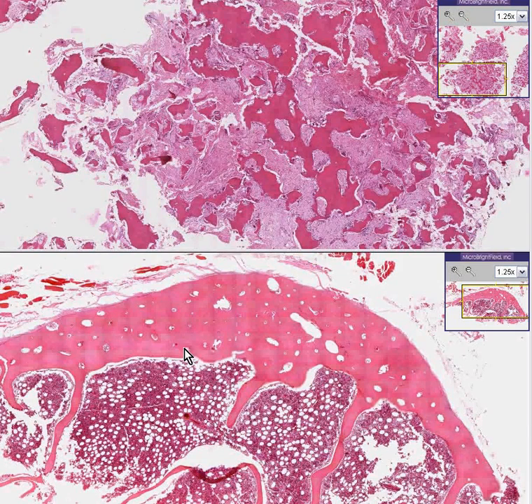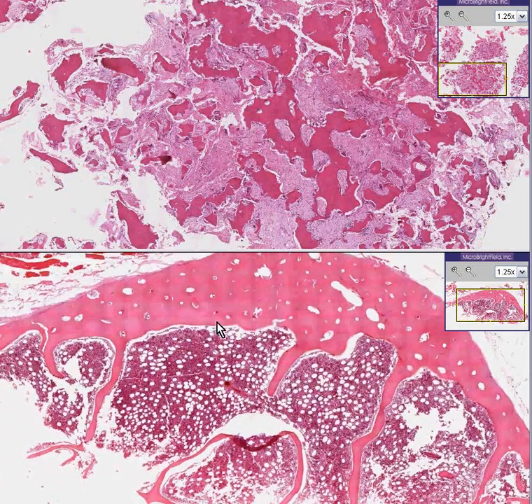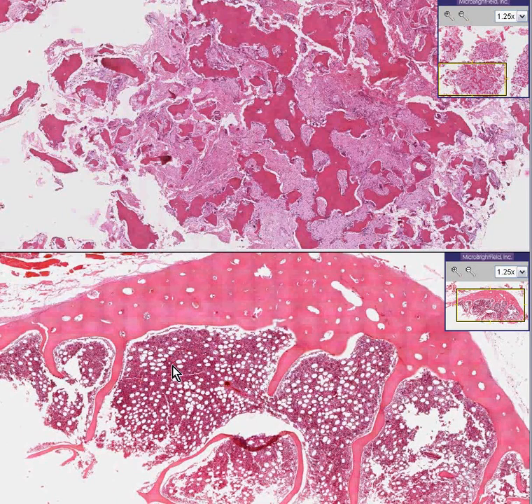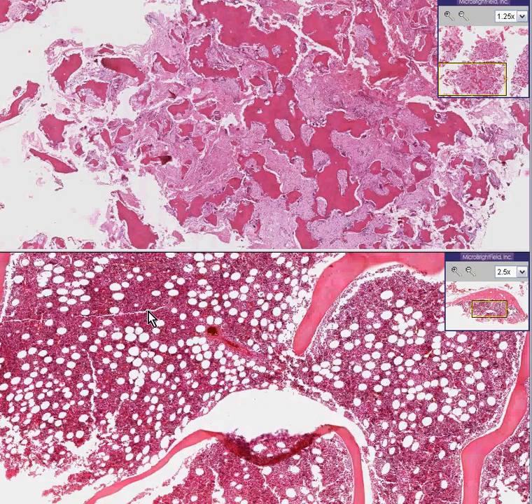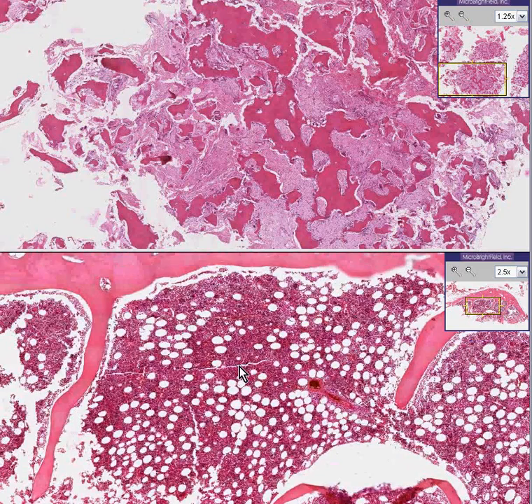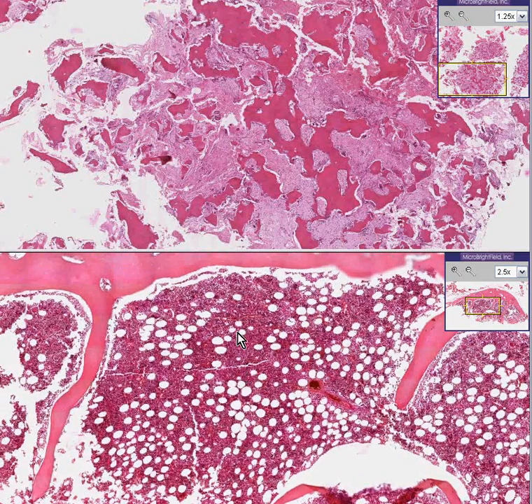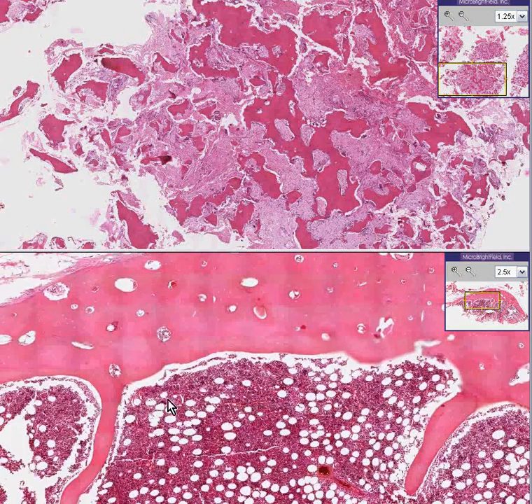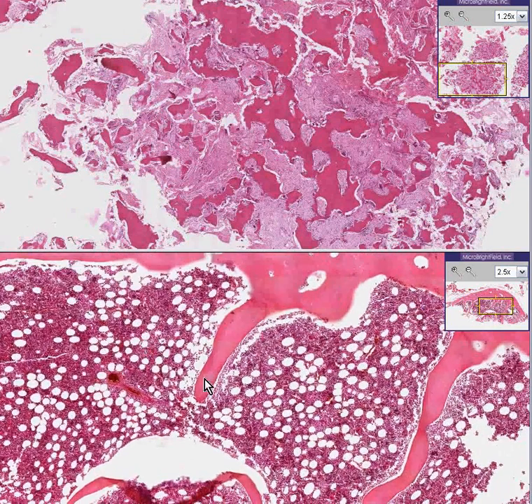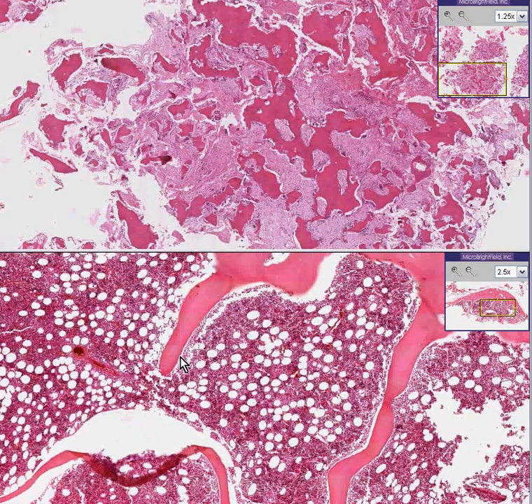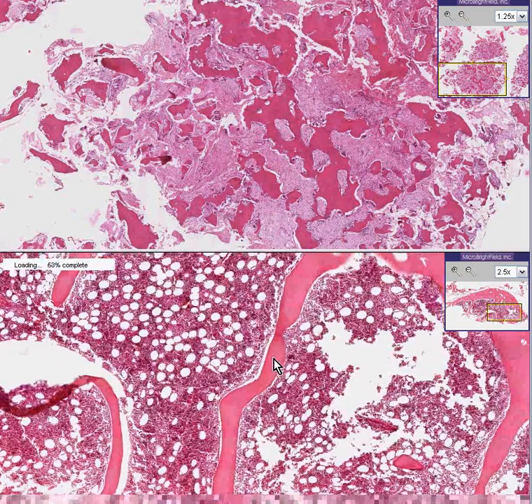Here is a normal bone at the bottom. You'll notice there's a lot of marrow, and in this case the bone happens to be a rib. About 50% of the cross-sectional surface of the marrow is fat, which is normal. If you want to study the general normal architecture of trabecular bone, here are the bony trabeculae or spicules.